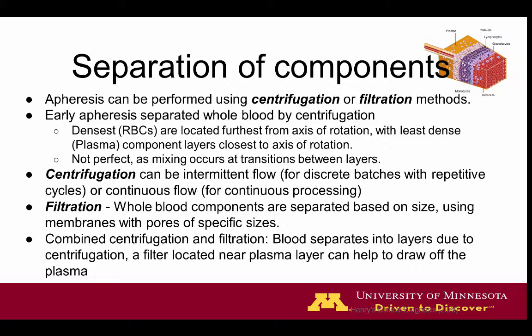One can also combine these two methods to attempt to attain the positive aspects of both methods, so as to lower the amount of G-forces or the forces needed to separate and spin the blood, and to actually further get rid of the issues with these transition areas as well.